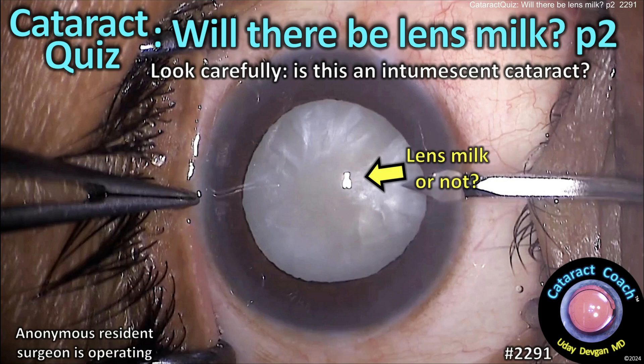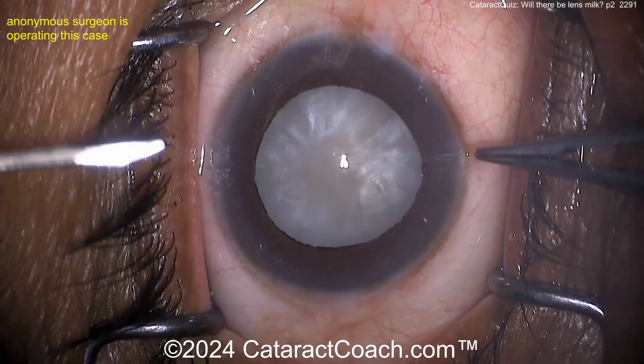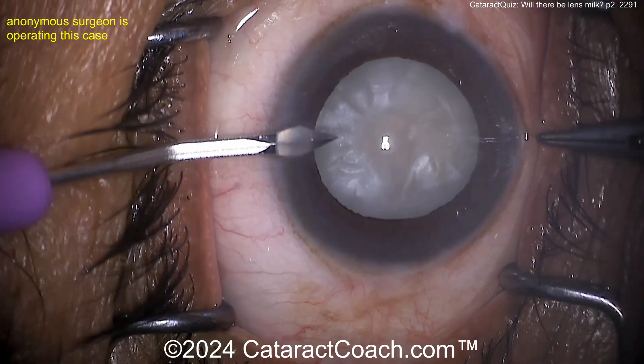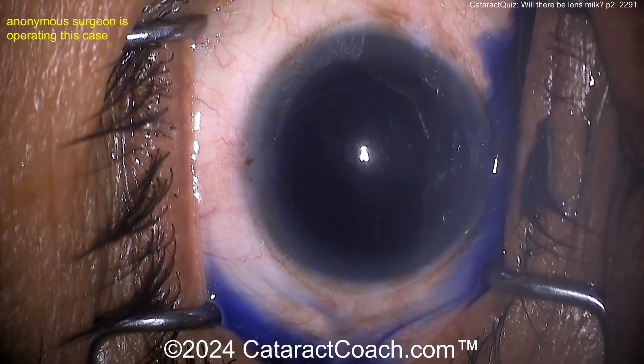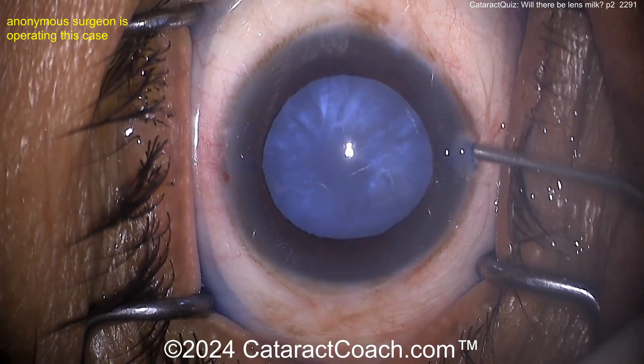Cataractcoach.com cataract quiz: will there be lens milk? Part two. Look carefully — is this an intumescent white cataract? It looks pearlescent, like a pearl. See that shimmer? There are water clefts present and liquefied lens material for sure. This is going to be an intumescent cataract.